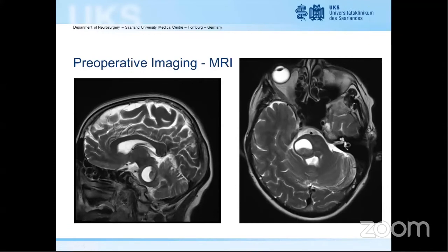Yes, I think wait and see is not a good option for this case because it is a hemorrhagic lesion and it has bled. And there is some compression. So it might bleed again, and this is not a good thing. Now the patient is having some neurological dysfunction, but not major. If she had another bleed, she might be more disabled. So I think surgical intervention to release this cyst and take the solid part from a right retrosigmoid approach would be a good option.